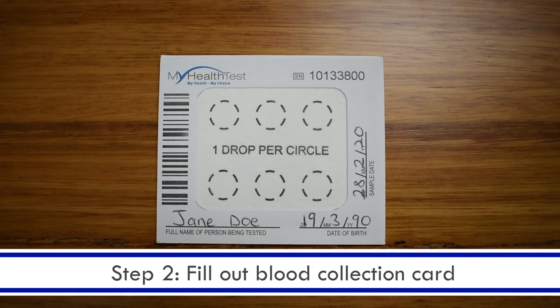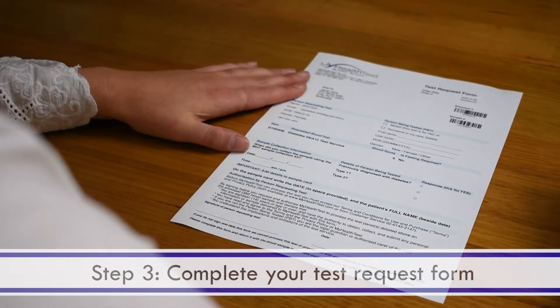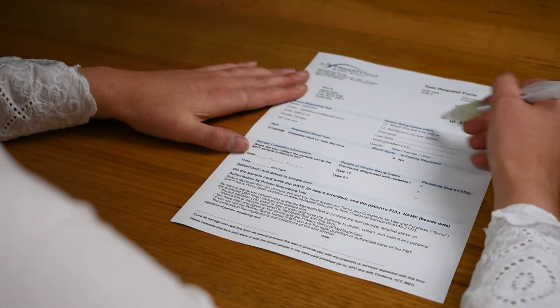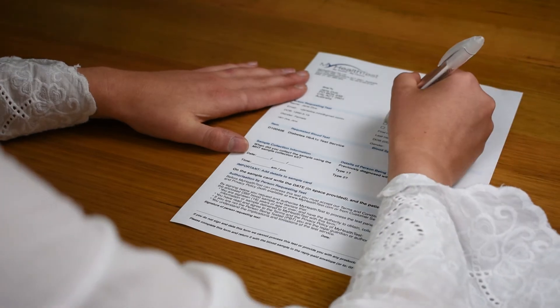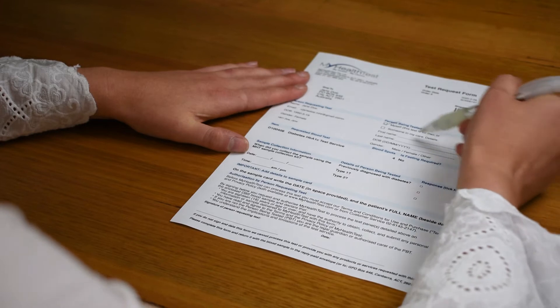Step two: on the blood collection card, write your full name, date of birth, and today's date in the spaces provided. Step three: complete the test request form. You want to tick who the person being tested is — if that's yourself, tick 'myself'; if it's someone in your care, fill out their details.